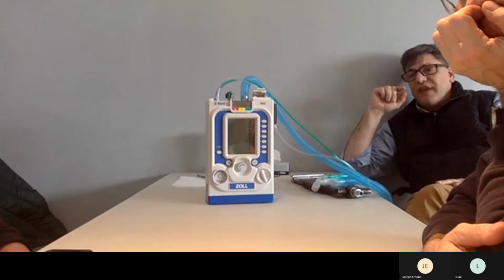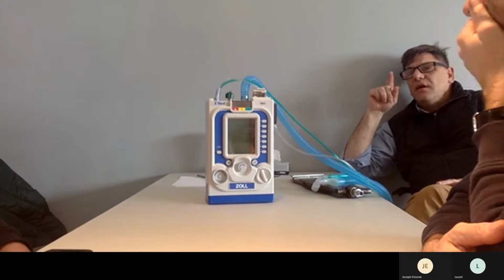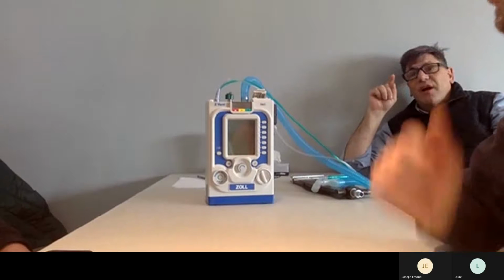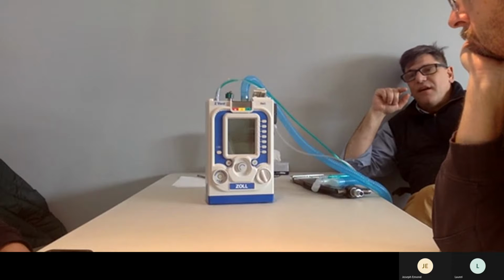The advantage of that is, in order to do CPAP, what does the patient have to be doing? Breathing on their own. With the bag, they don't have to breathe on their own, and I can feel the difference. But CPAP is better because it's continuous, so we recruit lungs all the time. We never lose that recruitment.